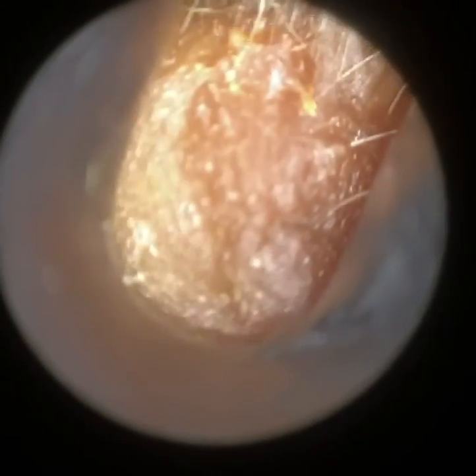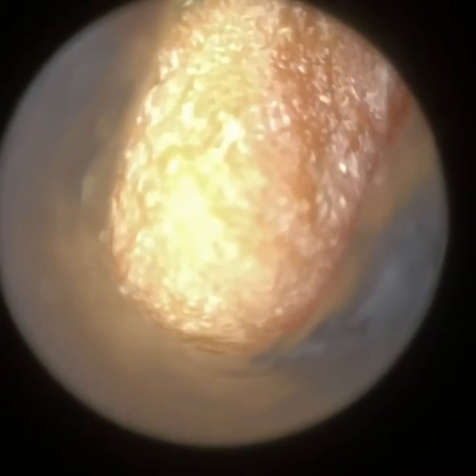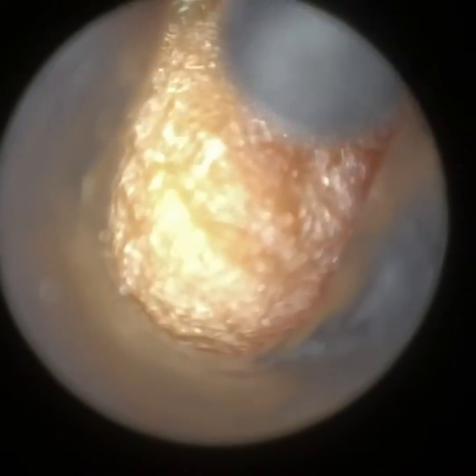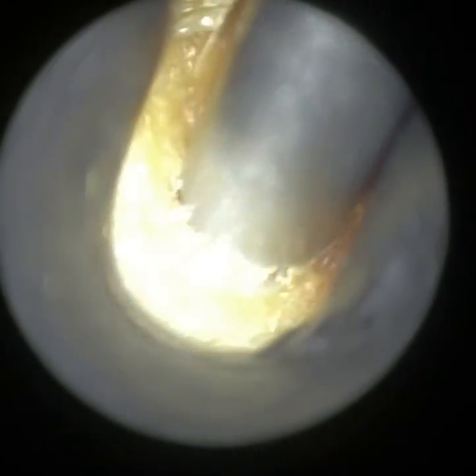Hi everyone, this is Mr. Neil Reiters, Consultant Audiologist and Director of Clearwax. Thank you for joining me in my latest demonstration video of our recently developed Waxcoat, which is due to be launched in early January 2023.